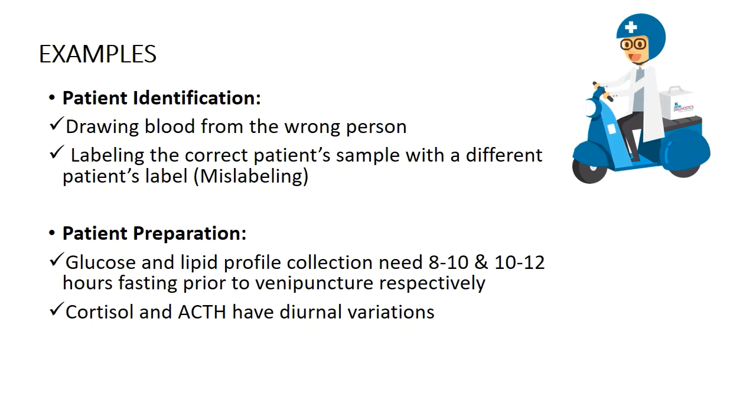Okay. So cortisol and ACTH have diurnal variation. You have to keep a note. If you are testing a patient's testosterone sample, it should be collected at around 8 a.m., because at that time is the peak of testosterone. Similarly, cortisol and ACTH should be collected at the right time, like for cortisol around 8 a.m.